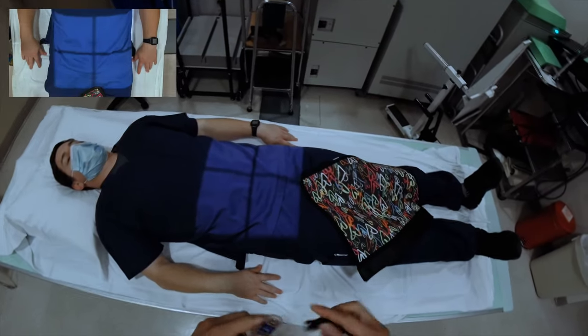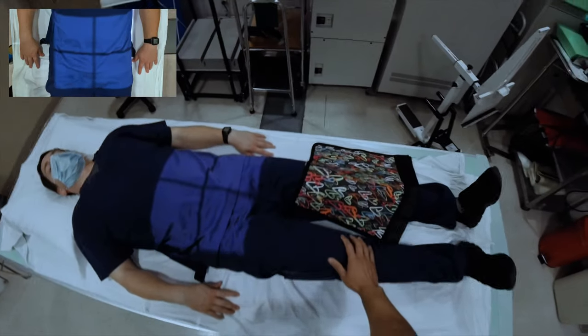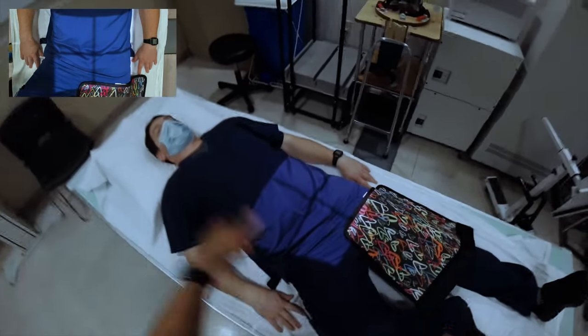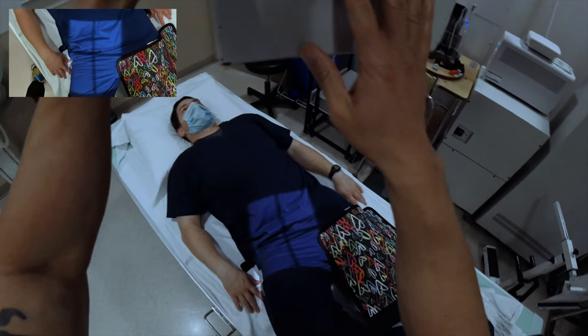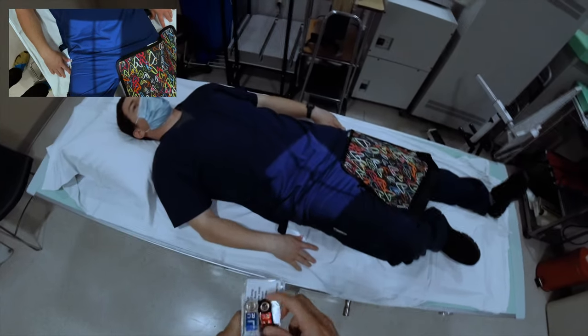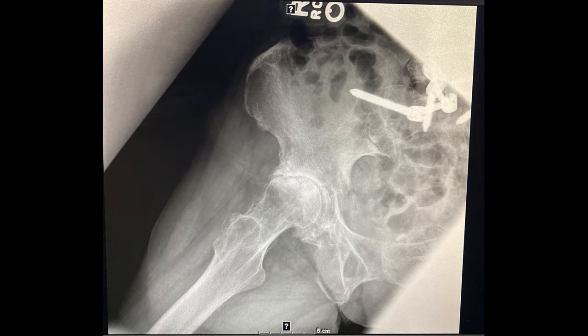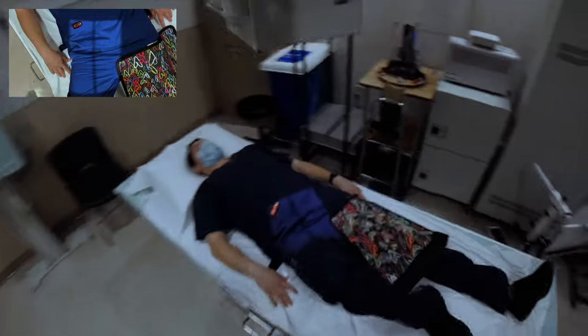All right, and then it's your right hip again, correct? Yes. Okay, so you're gonna bring your right knee up about halfway. Right about there, you're gonna drop your knee down towards me halfway. Right there is good. And then I'm just gonna feel your hip here again, all right? Hold still. Alright, you can relax, we're all done.